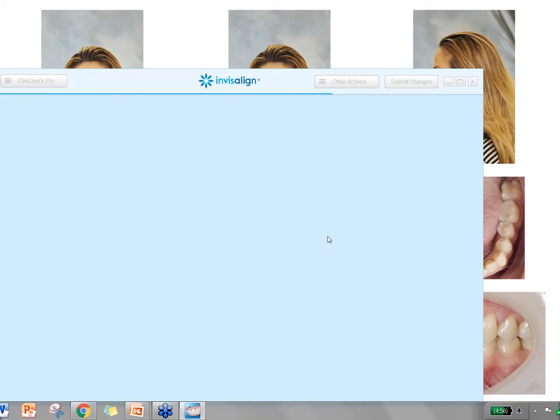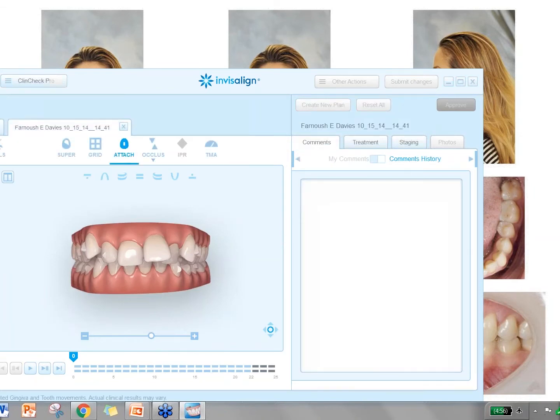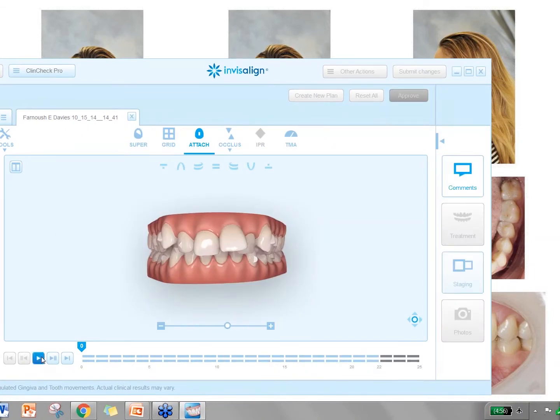And you can see here from the Clincheck, once it opens, that she had 22 aligners. I'm sorry, 22 aligners, top and bottom, on her first go-around. And we'll just play through it real quickly. You can see the power ridges where they show up to help torque those roots. And again, I said number 8, although number 9 looked like the one that was way out, number 8 was the one that I was torquing the root on. We did perforations along the top here, but in particular I was concentrating on tooth number 8.